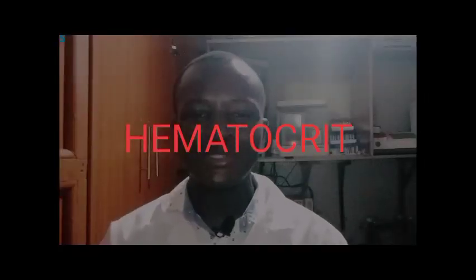So the next component of RBC that I want us to speak about is called the hematocrit. So what is hematocrit? Hematocrit is a measure of the percentage of the total blood volume that is made up of red blood cells. I hope we are clear. So we take the entire blood, whole blood, all of it that we have measured, and we want to see what is the ratio of RBC to the total volume of whole blood.